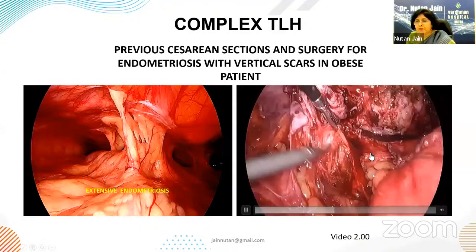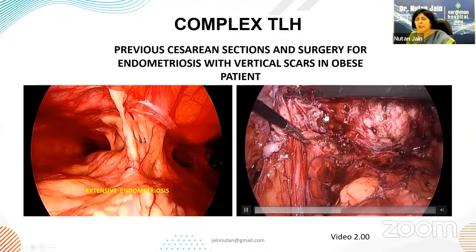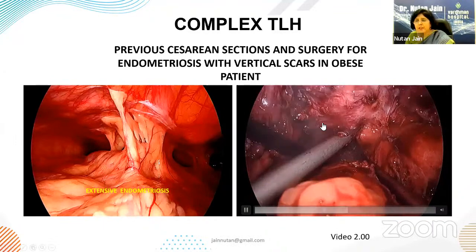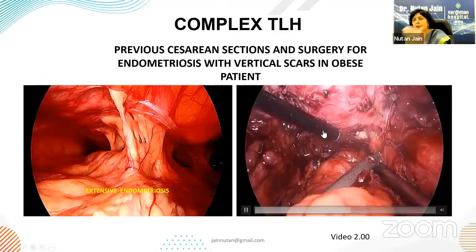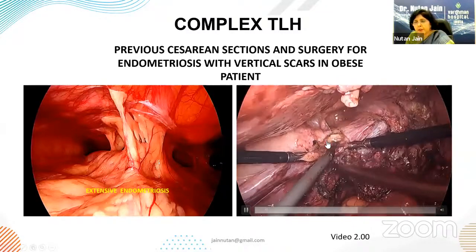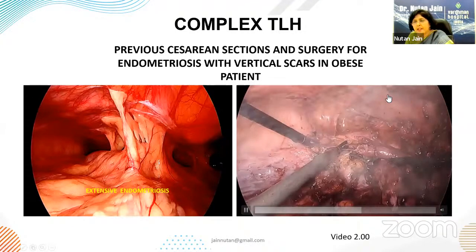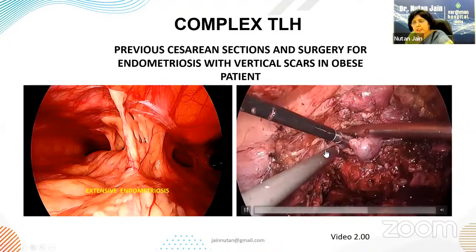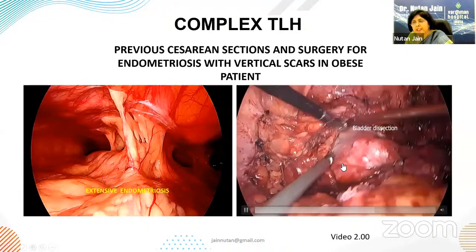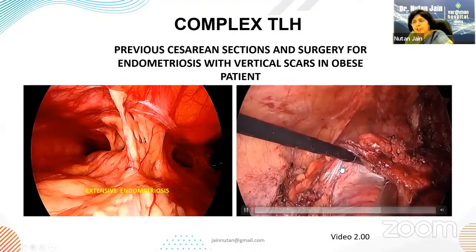We take all precautions to keep away from the bowel. And so it was an open and shut case at some other place. In this case, because we knew, we had tried stenting the ureters. And that was a dissection completed in the pouch of Douglas. Now anteriorly we are working, this is the bladder and this is the adnexa. My point over here is, just see how easily the bladder has gone. It is such a nice plane of cleavage that we get.